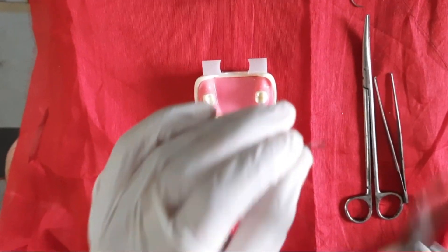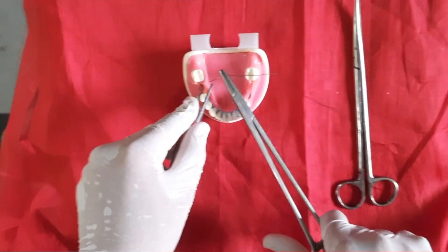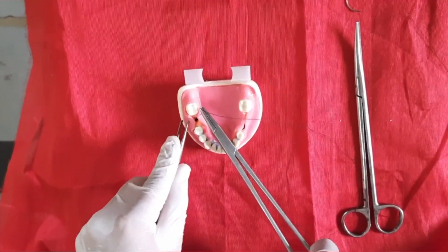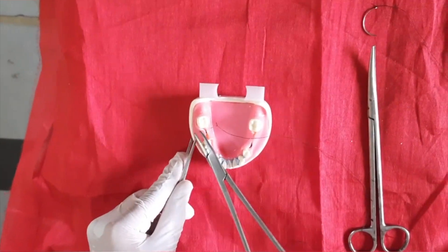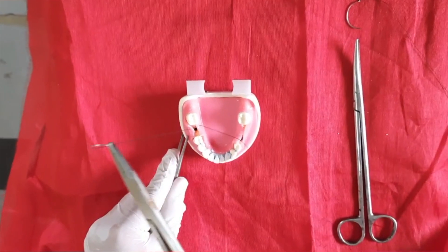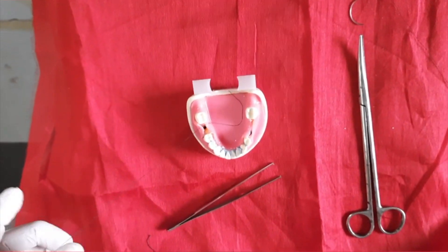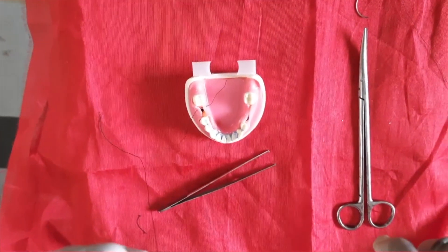The second type is the horizontal mattress suture. Hold the needle properly and elevate the tissue flap. Enter the needle and remove it from the other side slowly. Pull the thread from the other side — be careful, slowly. Leave some extra thread, then again hold the needle.